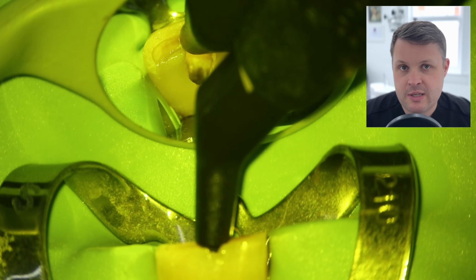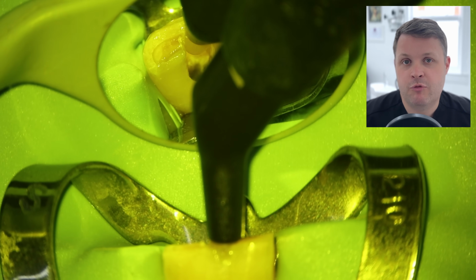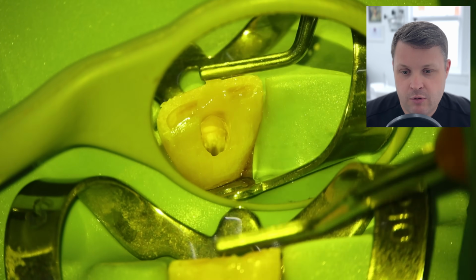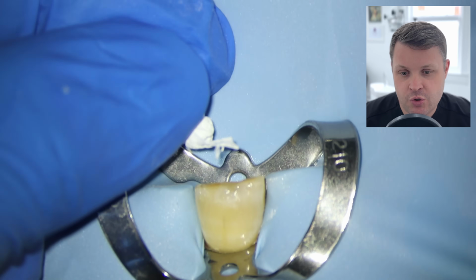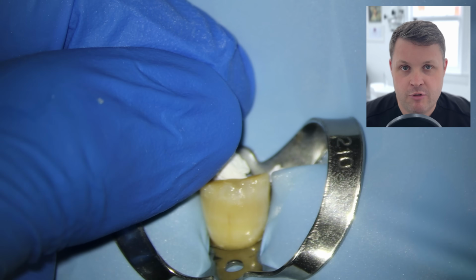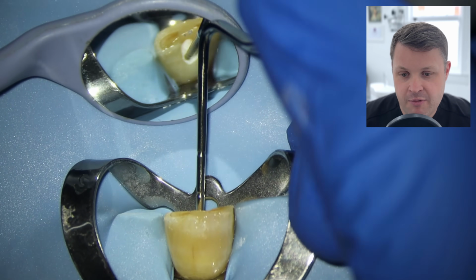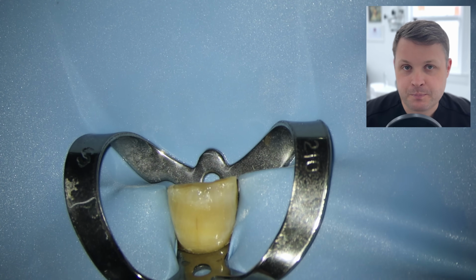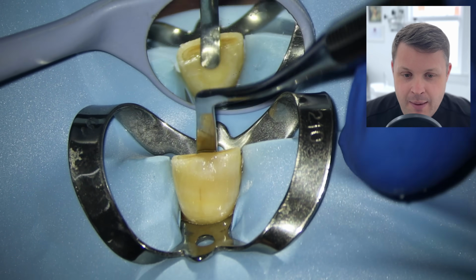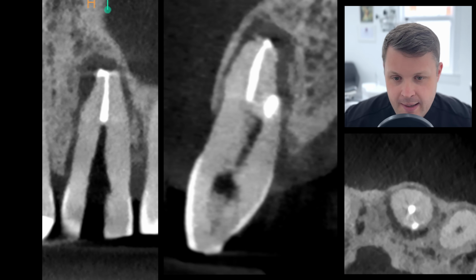So what I'm going to do is a kind of hybrid approach here. I am going to repair the incisal edge with a proper composite. I'm going to make sure that all looks nice, but I'm also going to leave space for the internal whitening. So once we've repaired the incisal edge of this tooth, I'm going to fill the tooth with PTFE and give it a bit of a clean up with the soft stone and obviously a bit of GI in the back. And when we look at the final cone beam CT scan, I'm super, super happy with this.